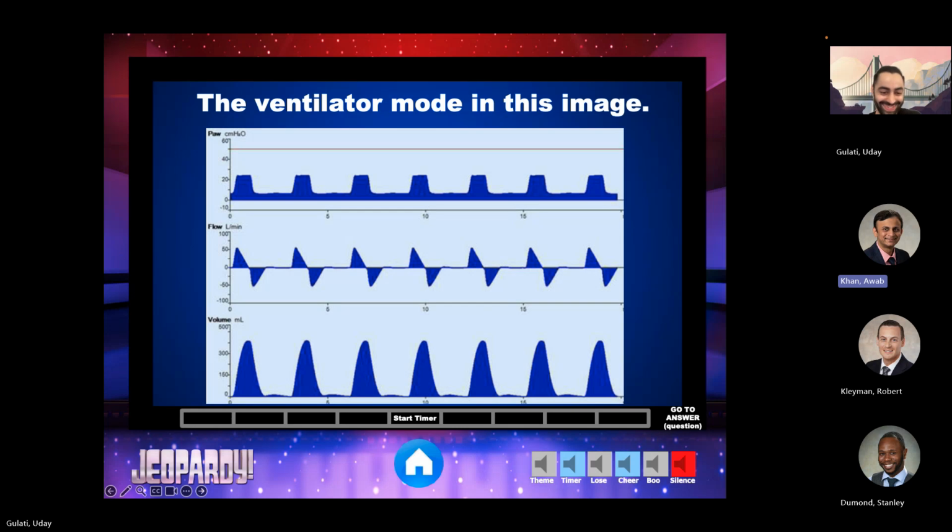Well, initially I was looking to see which one varies, but then we were looking at the one that was flat on the top. Which one was consistent? The pressure was consistent. The volumes in theory should vary, but they were the same. Yeah, that is a good start. You want to be careful about that approach. And maybe Jared's about to say why.